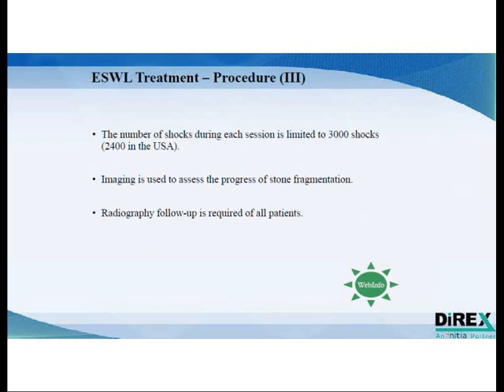Usually, a stone will break with less than 3,000 shocks. In some countries, this amount of shockwaves is regulated. For example, in the United States, they allow only up to 2,400 shocks before you have to interrupt the treatment and the patient will have to come back.